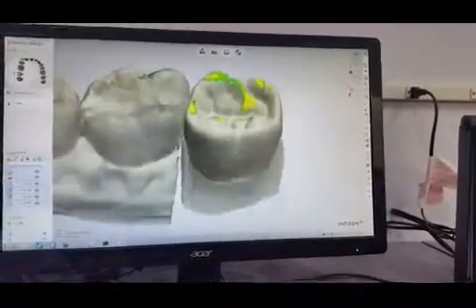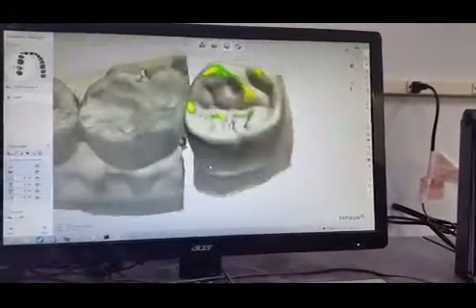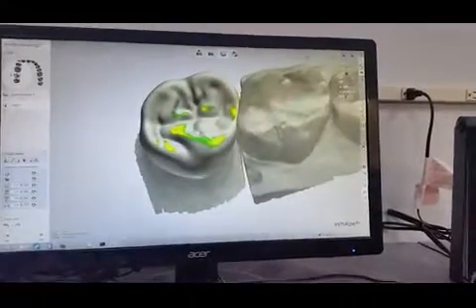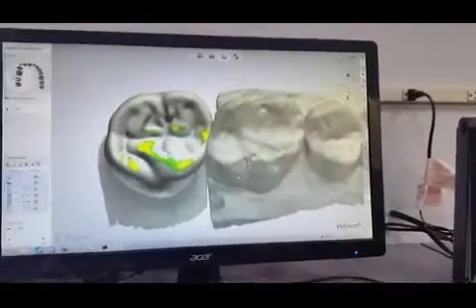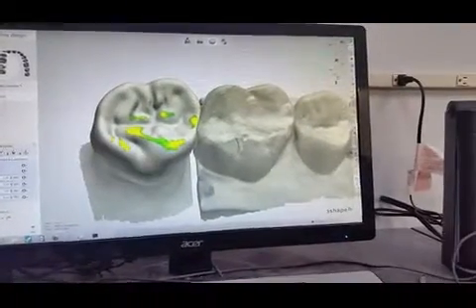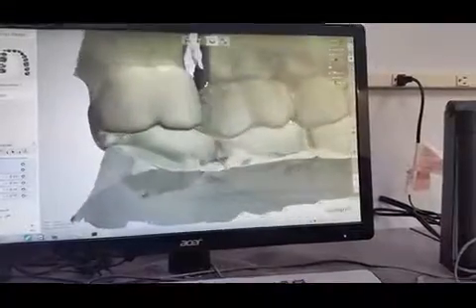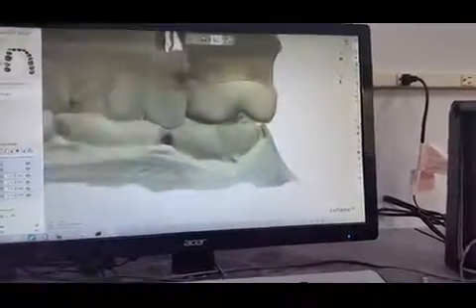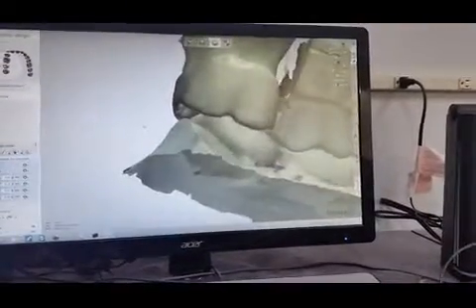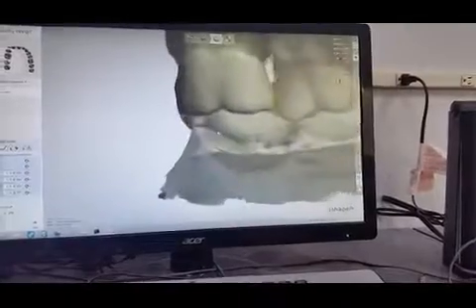Sometimes they're a little prettier than this, but of course the better or the more occlusal clearance that we have, the better looking crown we get. But because we have the opposing going pretty deep and heavy, it's kind of limiting us from doing everything that we'd like to do. But for what we got to work with, this is going to turn out just fine.